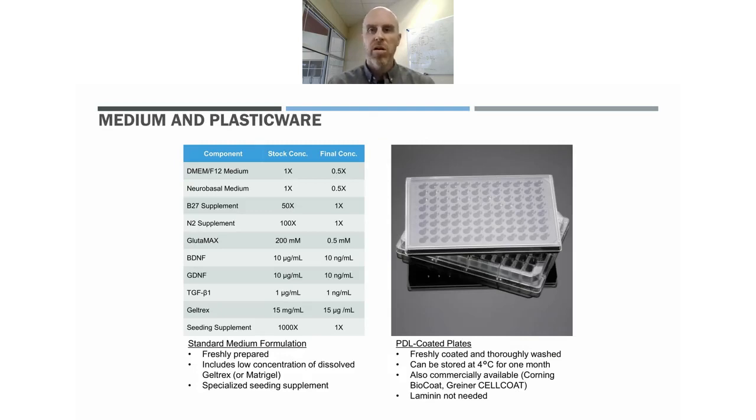The one piece of advice I have when people are starting to work with these cells for the first time is that they're sensitive cells, versus, say, an indestructible cell line, so you need to be careful with what you do. They can be somewhat finicky, so you need to take care in doing proper coating, proper washing, and obviously, media formulation is certainly important. Different from working with an immortalized line typically, because they'll be more sensitive to the manipulations you're doing with them.